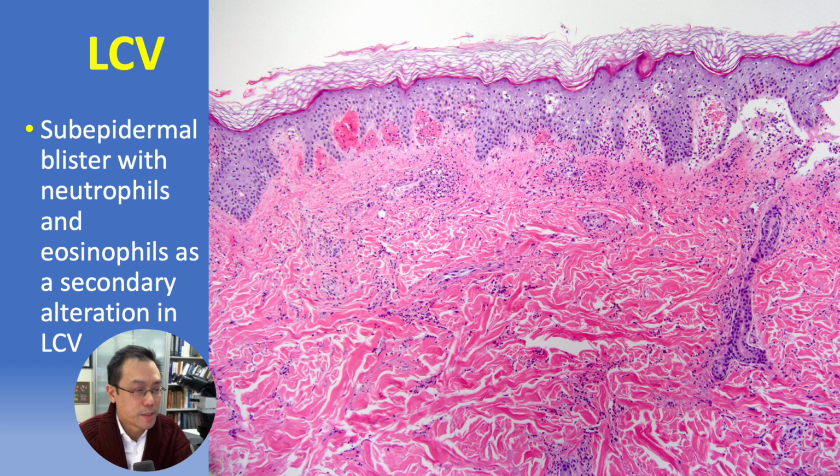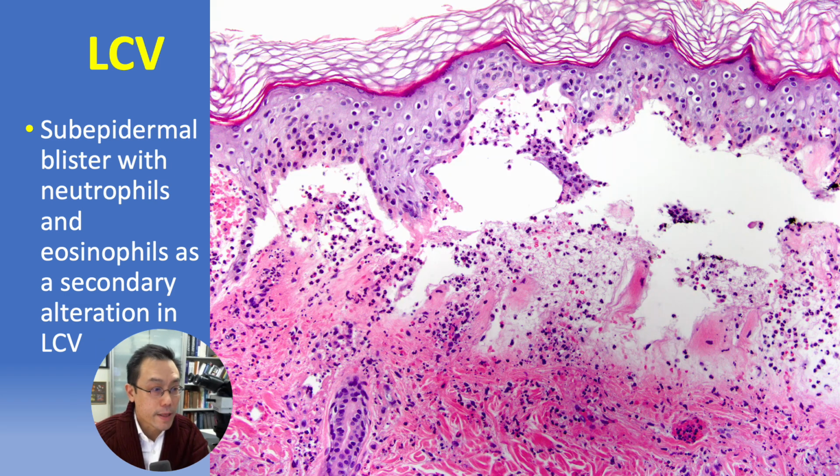So there's a potential for getting distracted by all the action happening around the epidermis and missing the diagnostic changes of vasculitis in the underlying dermis. So I think the first way out of the trap is simply to be aware of the fact that leukocytoclastic vasculitis can cause a fairly wide variety of secondary overlying changes that mimic immunobullous disorders with neutrophils.